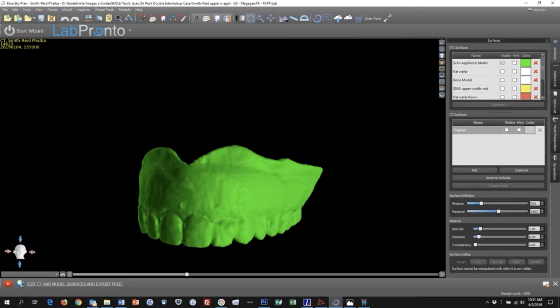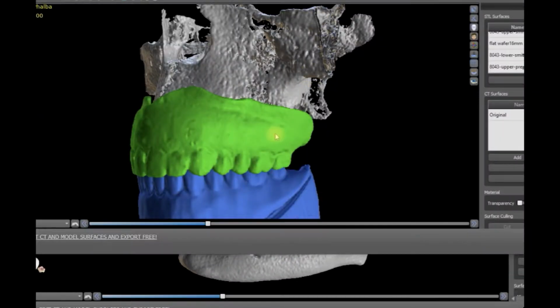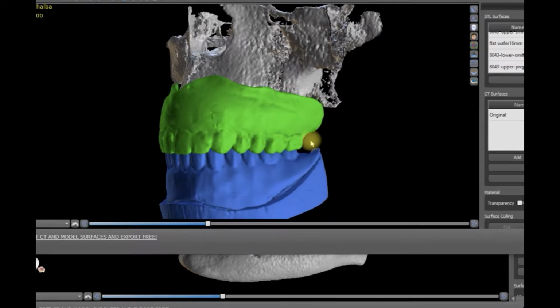Then you will export all 3 scans: the scan of the upper appliance, scan of the lower appliance, and the scan with both appliances inside the mouth. The important part of this is that the scan in the mouth captures every part of the patient from near the chin up to the nose.